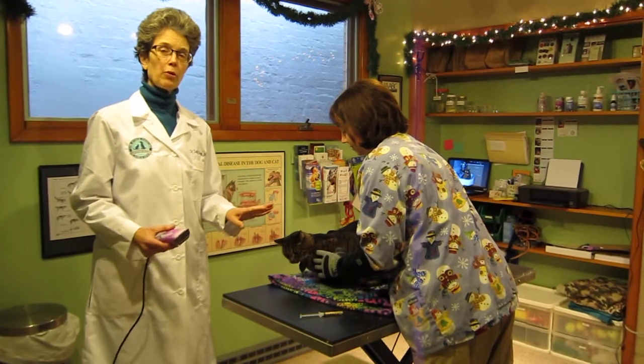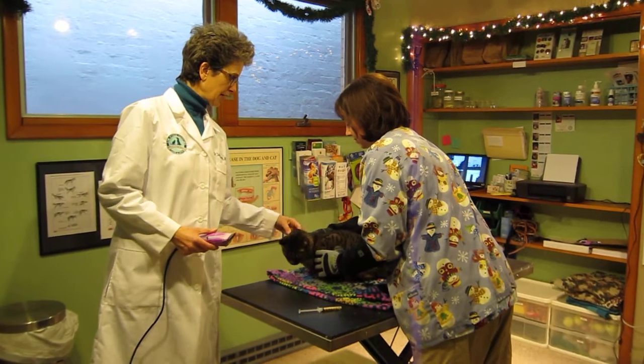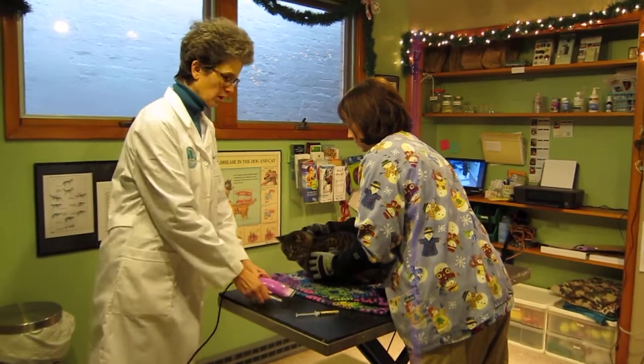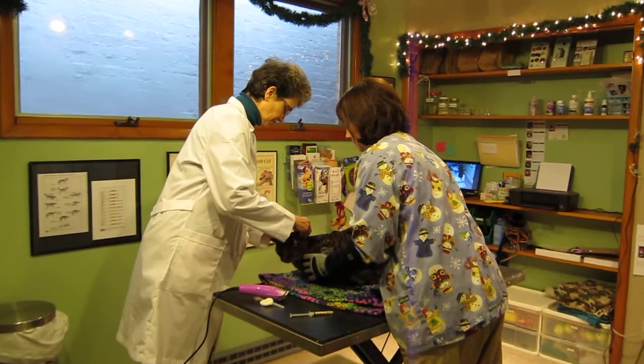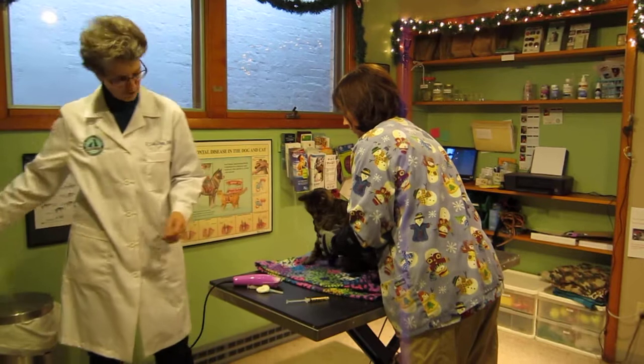We wanted to show a low stress blood draw technique here on Ranger, and that's a way of just elevating the head to draw the blood. So what we're going to do is take off his little collar. And as you can see, he doesn't mind the touch or the feel of the gloves.